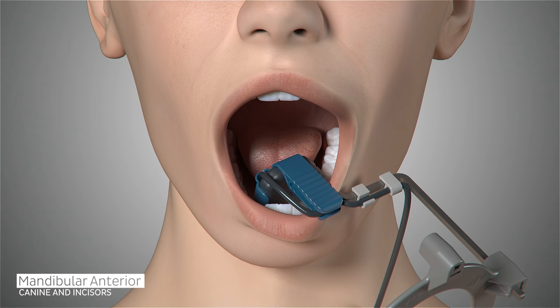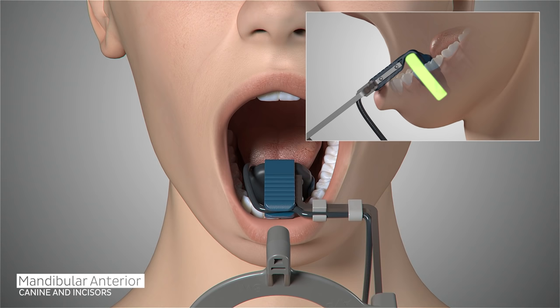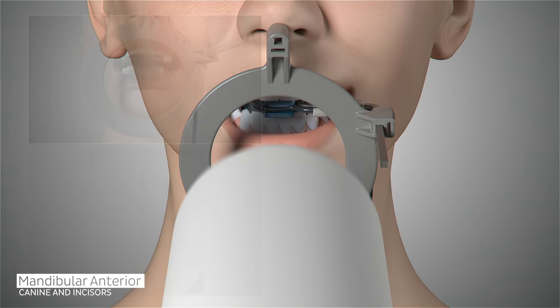Ask the patient to open in order to reposition the sensor to the midline for capturing the central incisors. Position the sensor so it is parallel to the roots of the teeth and as far into the patient's mouth as possible without causing discomfort, usually as far back as the second premolar. Ask the patient to close gently, slide the aiming ring as close to the patient's chin as possible, place the x-ray emitter cone flush with the aiming ring and trigger the exposure.